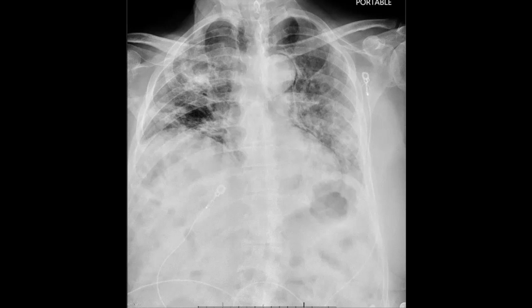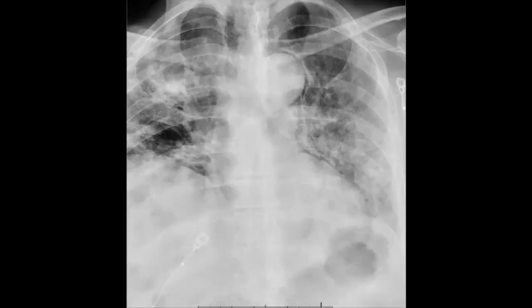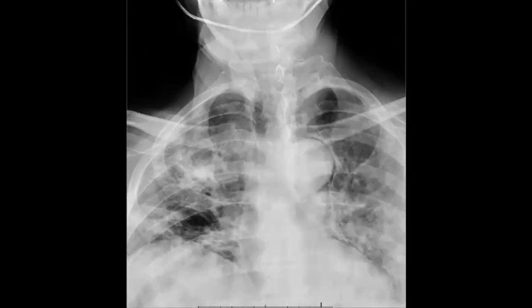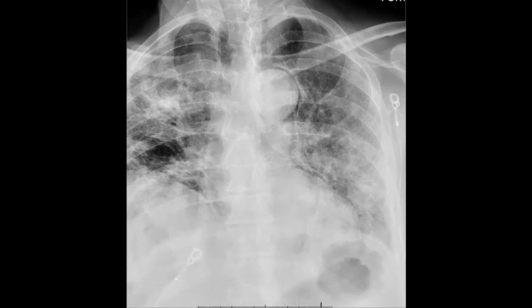But in addition to that, we actually see something else which is pretty interesting. We see these lucencies — curving linear lucencies along the left part of the heart and around the pulmonary artery as well. Nothing going to the neck. Very often when you see what I think this is — pneumomediastinum, proven on CT — you see a little bit of gas extending to the neck at times, but nothing there. But certainly this looks great for pneumomediastinum.